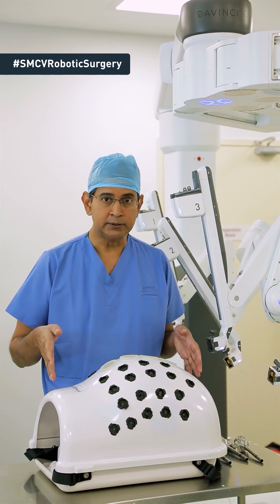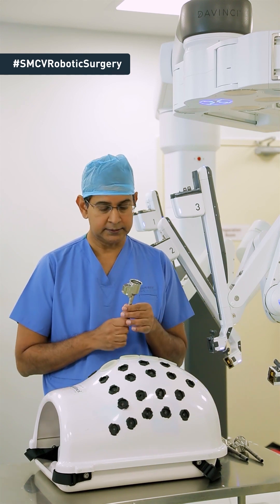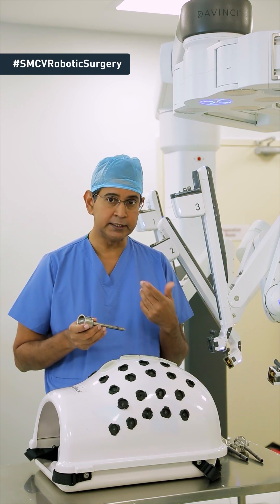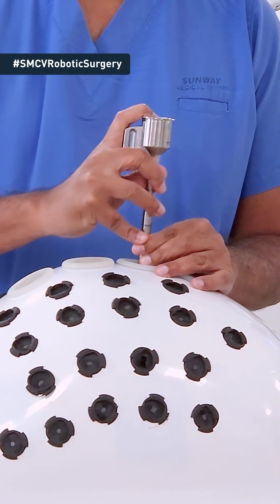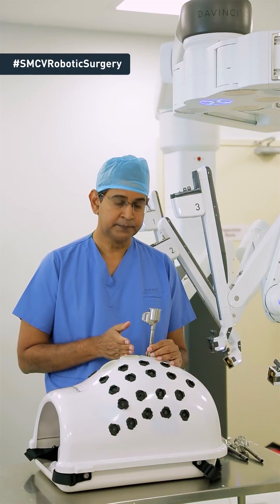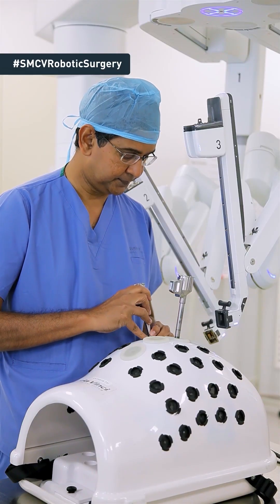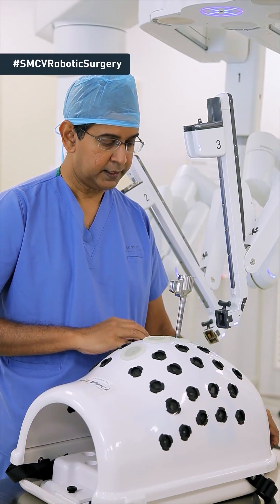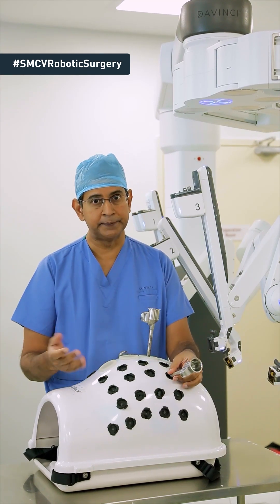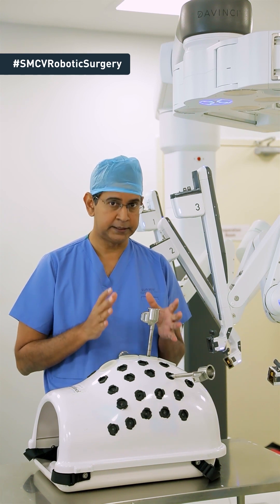So let's look at this model — assume that this is your tummy. The initial preparation is by inserting a port. This is called a port, and we insert it into your tummy. Surgically, we insert a port usually in the midline just above your navel, and we insert the other ports alongside like this. For the surgery, normally we may use up to about four to six ports depending on what type of surgery you're undergoing. This is the initial stage where we do the port placement.